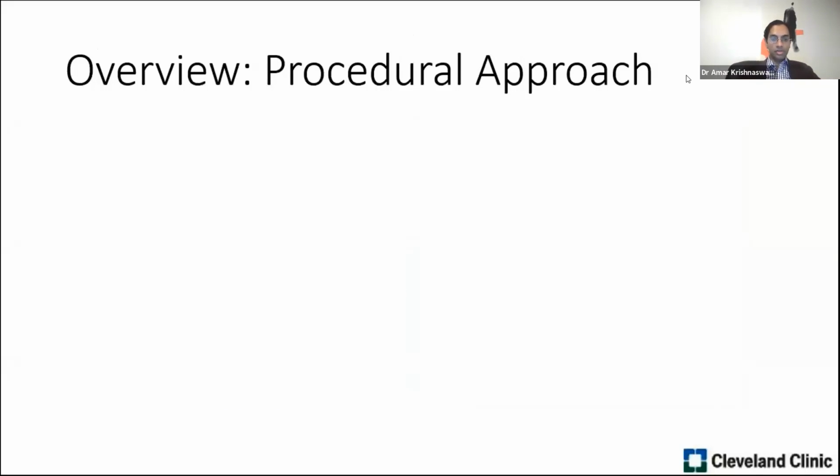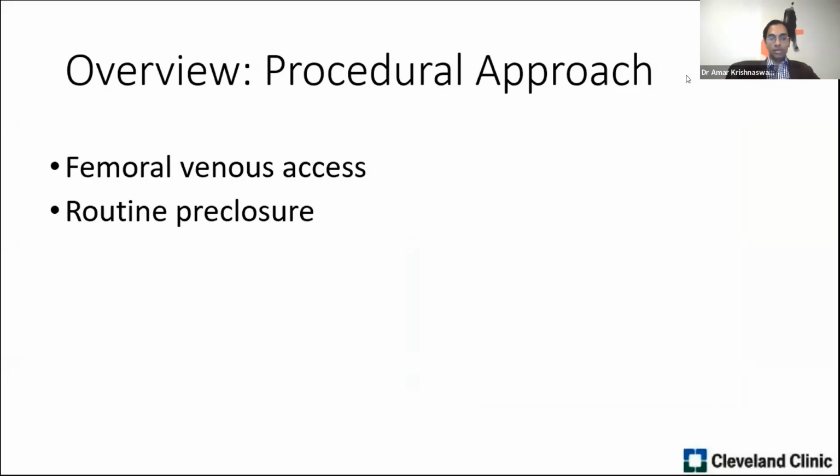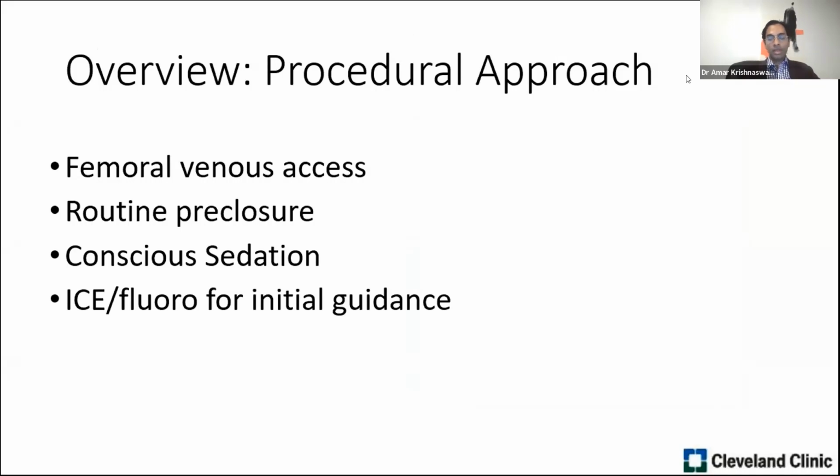Generally, our procedural approach in these mitral PVLs is we do these procedures, of course, via femoral venous access with a routine pre-closure using the Perclose ProGlides. Our practice pattern at Cleveland Clinic is to do these procedures under conscious sedation. So we perform the transseptal puncture using intracardiac echo and fluoroscopy.